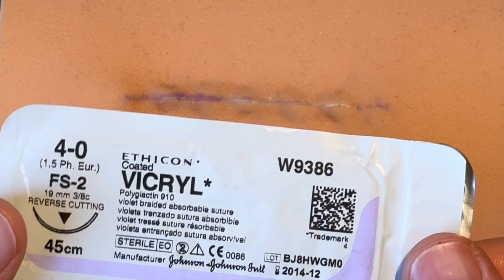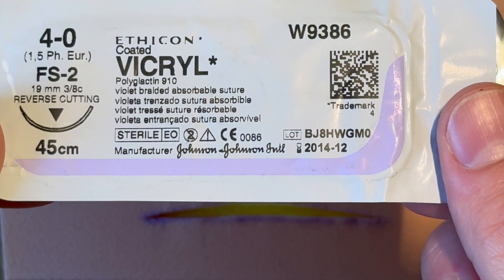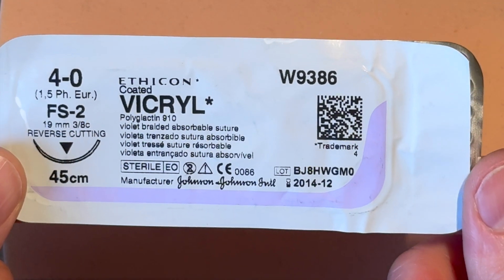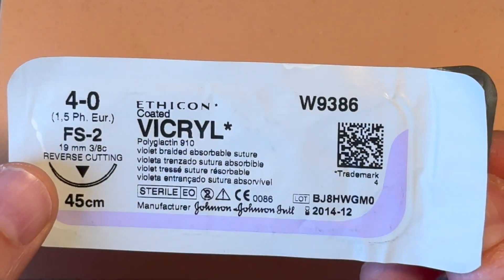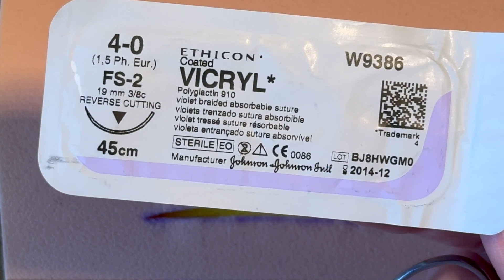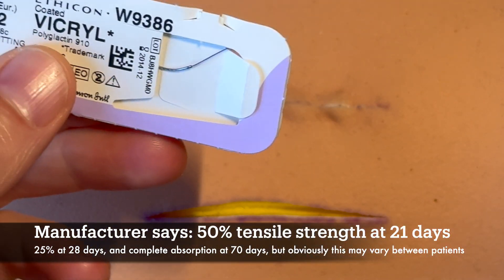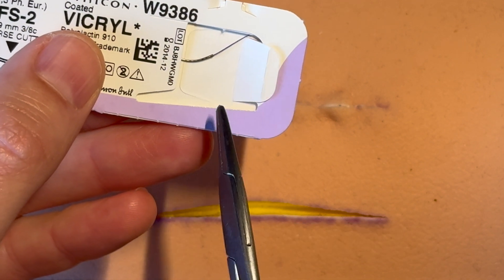So how do you place those stitches and what do you use? You're going to use something like this — a typical absorbable suture. This one happens to be a braided Vicryl, and this is going to last a few weeks to a couple of months. There's a difference between how long the suture material lasts and how long it's actually holding strong. Open up the packet — packet within a packet as with everything.